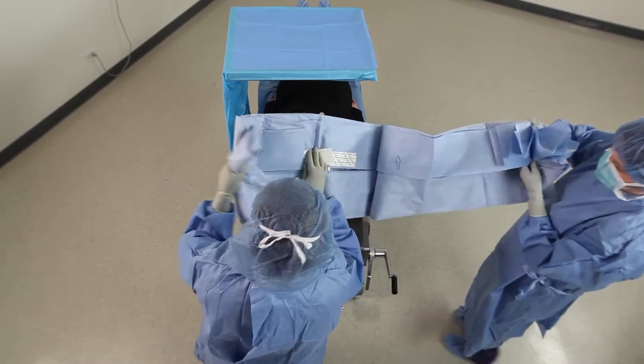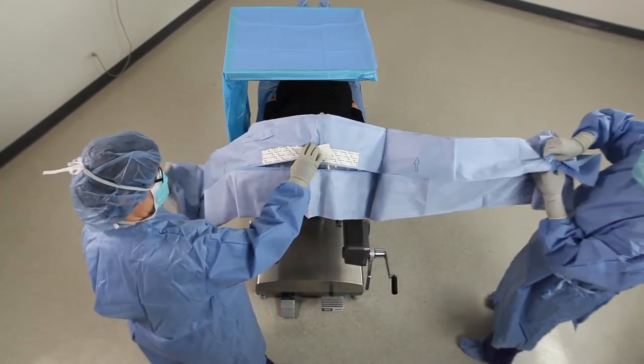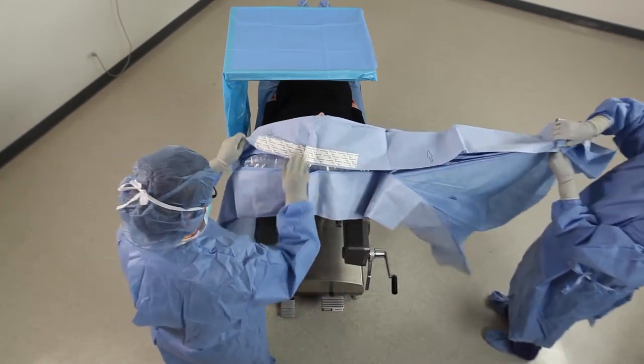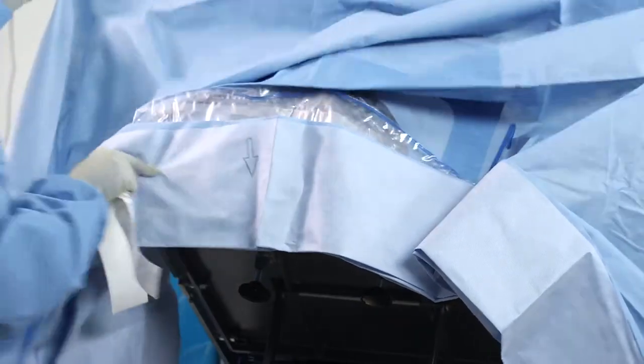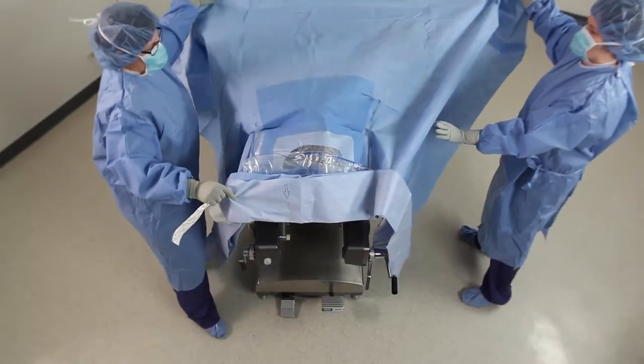Follow the directional arrows and open to the sides. Remove the release liner to expose the adhesive strip. Follow the directional arrows and open the drape.